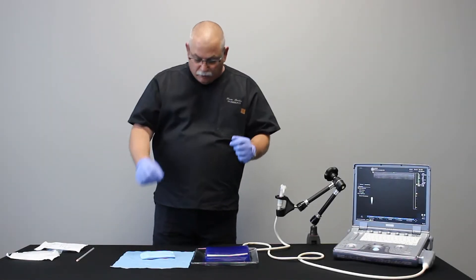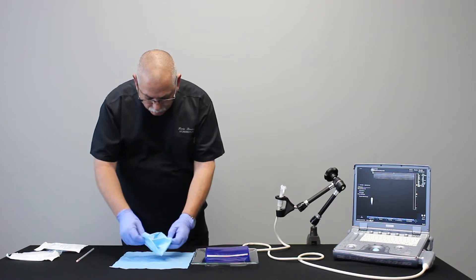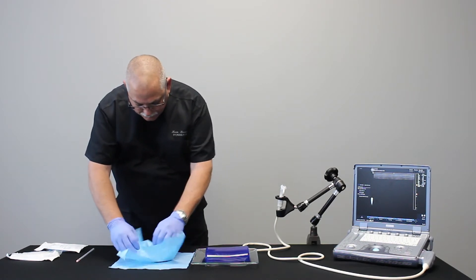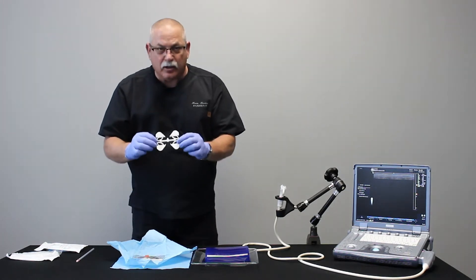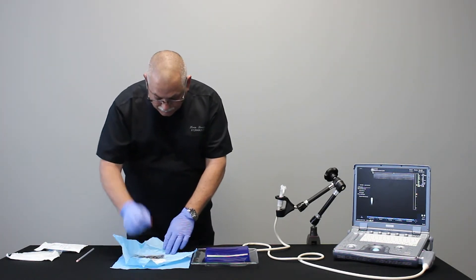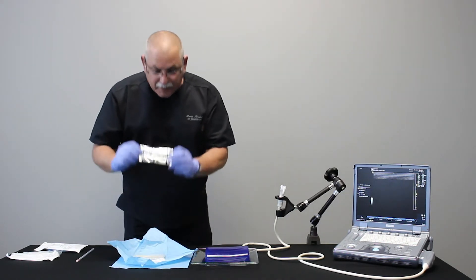Now I have sterile gloves on. I can open the package and inside will be three things: the needle guides themselves, elastic bands that go with the probe cover, and sterile gel.